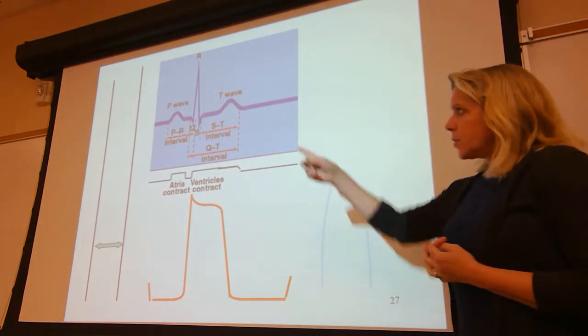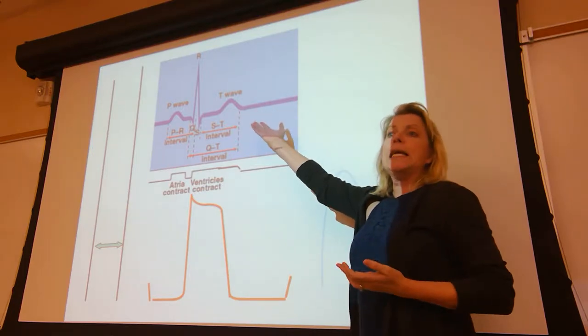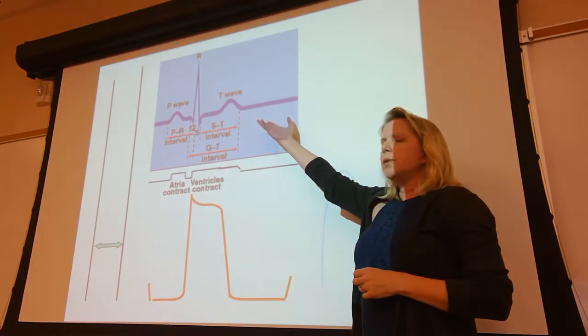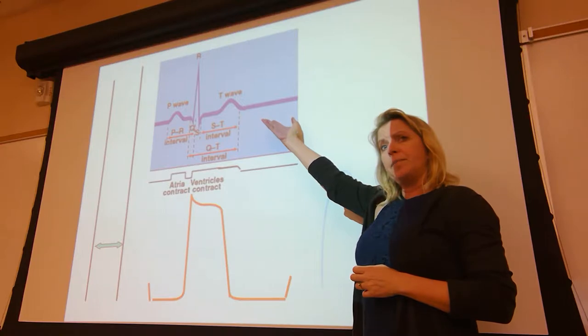So on the screen up here, you see an EKG tracing. Which lead is probably used for the comparison, for the recording lead? Two. If it were AVR, what would that picture look like?